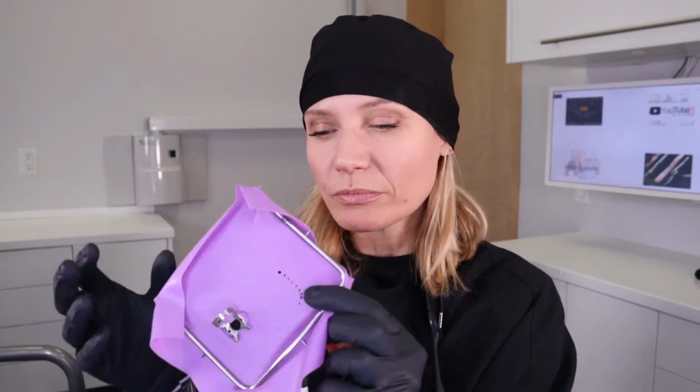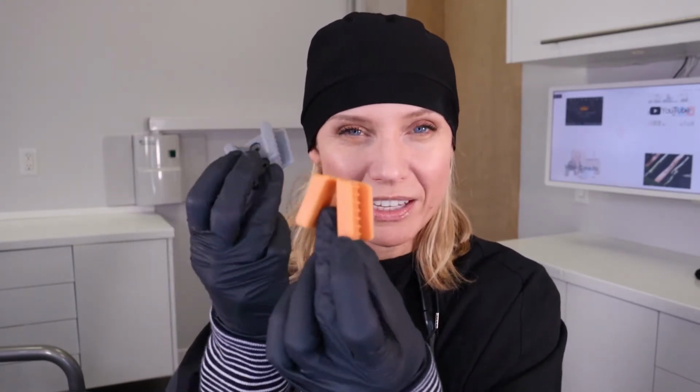Like that. So once that's on, sometimes I find patients just find it so hard to stay open. So I have these handy little what we call bite blocks. They come in different sizes, and these are a lifesaver, especially for pediatric patients. I always want to have a little bite block in there because A, I don't want to get my fingers bitten, but little kids can't keep their jaw open. And that goes for adults as well. If it's a long procedure, it's really tiring, the jaw muscles will get really tired. And so we always do that.